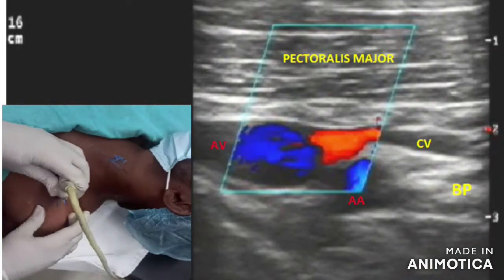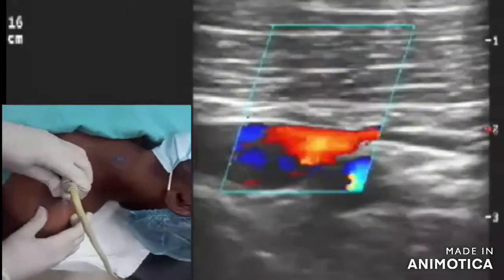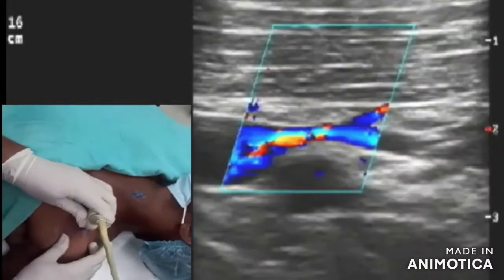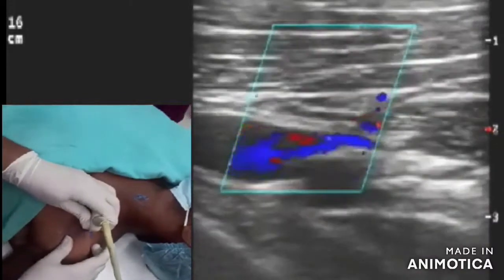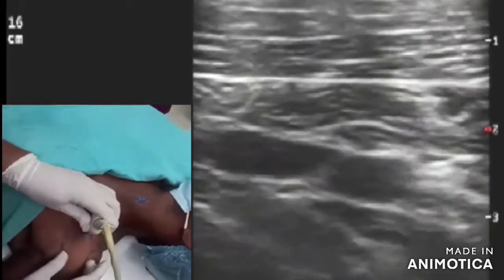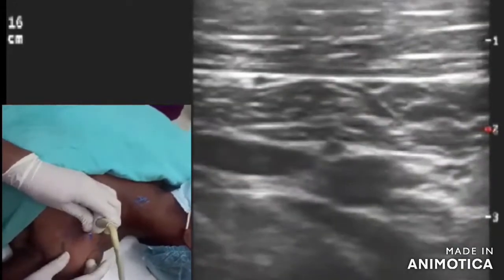Here you can see how the cephalic vein empties itself into the axillary vein as we go a little bit lateral. It is therefore our goal to tilt the probe slightly cephalad so that we can avoid cephalic vein puncture.